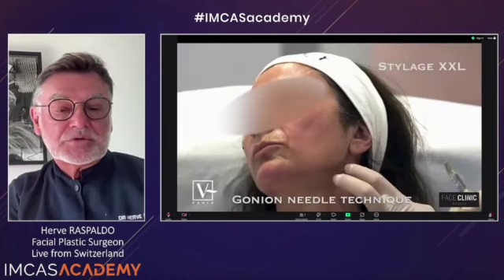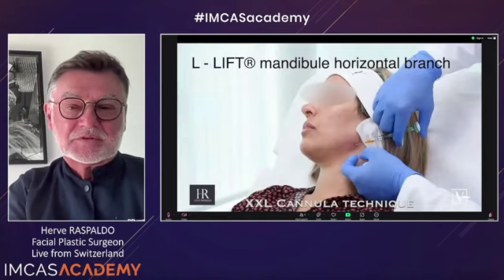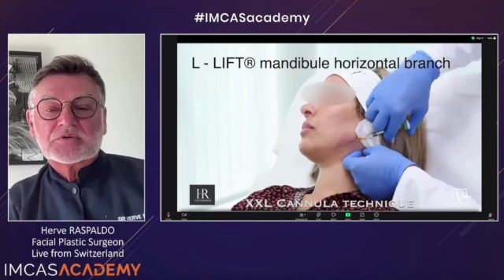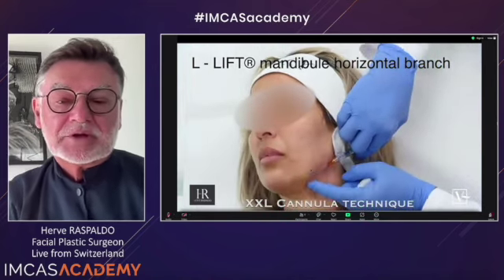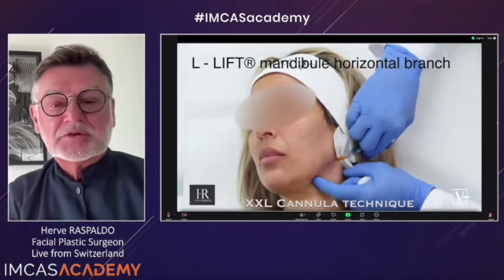I just want to show you something which is interesting, the indentation that you need now to do from the gonion there. So I prefer to use the needle because I feel where I am and I want to inject really deep. With the mandible, with the cannula, it's not so easy. And then, of course, I use the cannula because I want to spread the product all along the mandible, 5 or 7 centimeter long cannula, 25 or 27 gauge, doesn't matter.